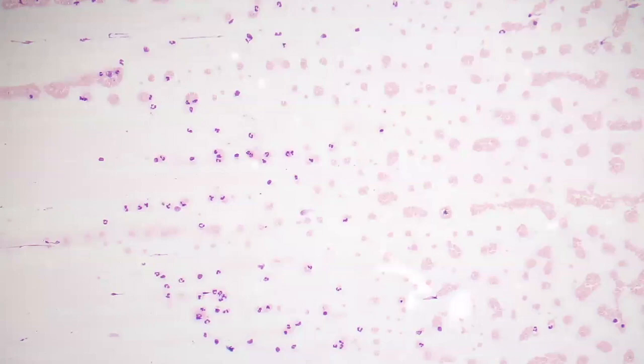Sickle cell anemia is also called hemoglobin S disease or hemoglobin SS, and is typically characterized by a severe anemia with a hemoglobin between 5 to 9 grams per deciliter. The cells are usually normocytic and normochromic and show variable degrees of anisopoikilocytosis and polychromasia.